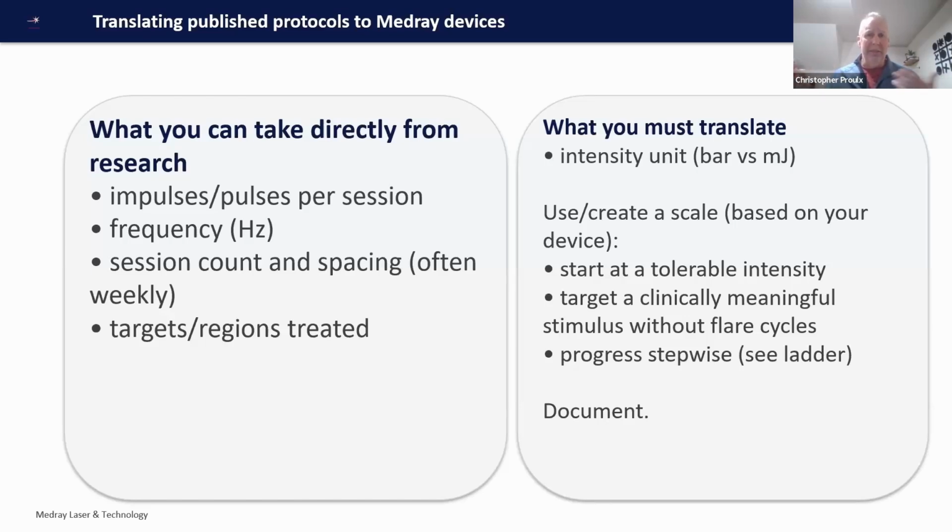That actually doesn't necessarily translate into the tissue. Now, if you have an understanding of your device and you know the surface area and the actual force that it's producing over a given surface area of your applicator head and over the tissue, then you could potentially calculate your energy flux density. Yeah, most of us don't really do that, and so we kind of just go.